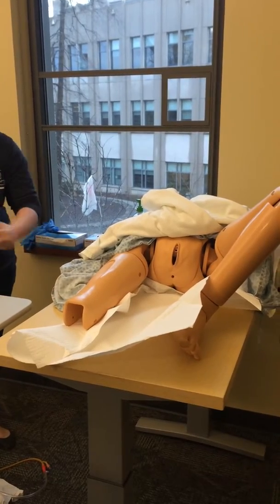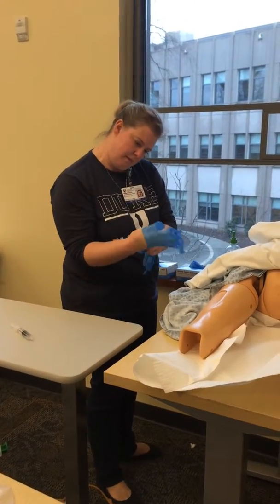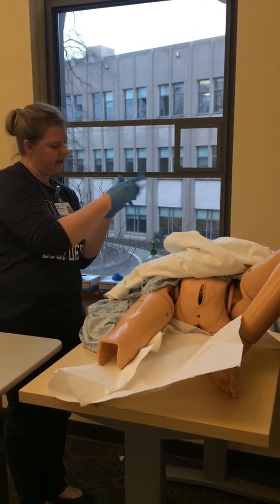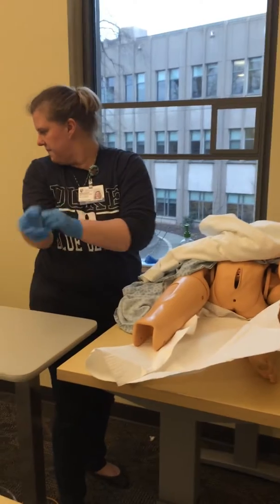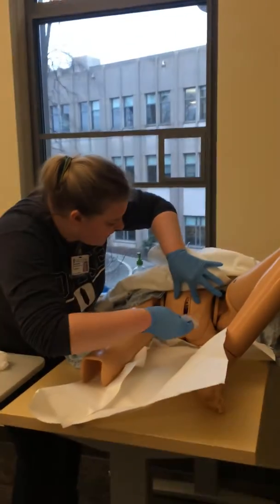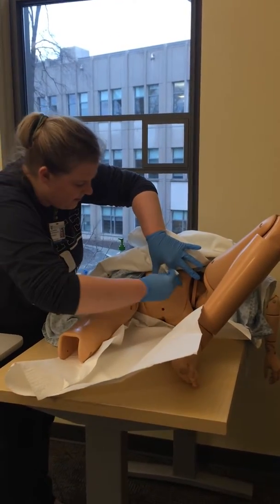Now I'm just going to clean the area real quick. We'll use some more hand hygiene and clean the area with a wipe. In reality, I would have some clean wipes to use, but for now we're going to reuse these from earlier. I'm going to clean just like before: down the right side top to bottom to your anus, down the left side top to bottom, and then down the middle top to bottom.